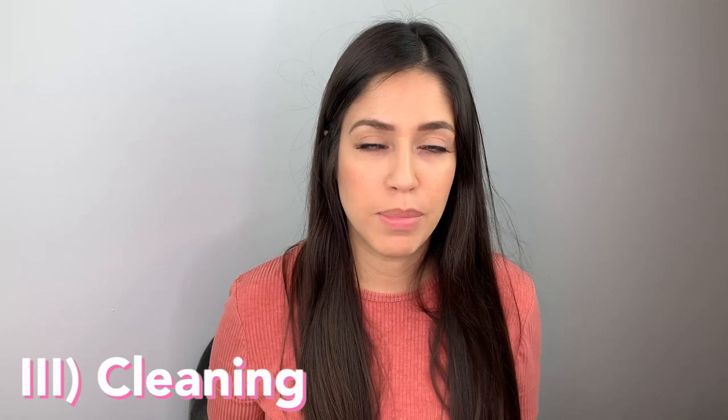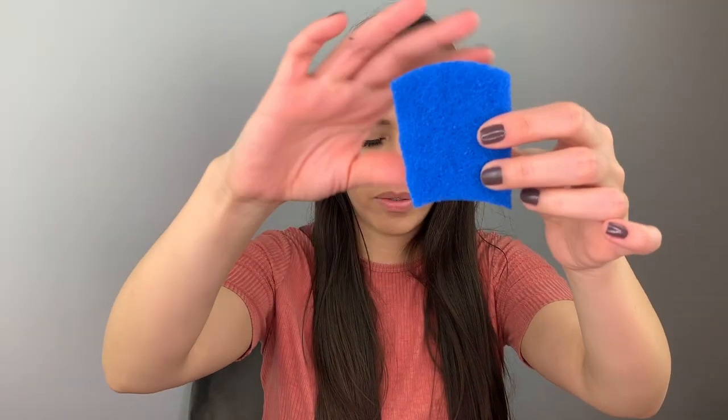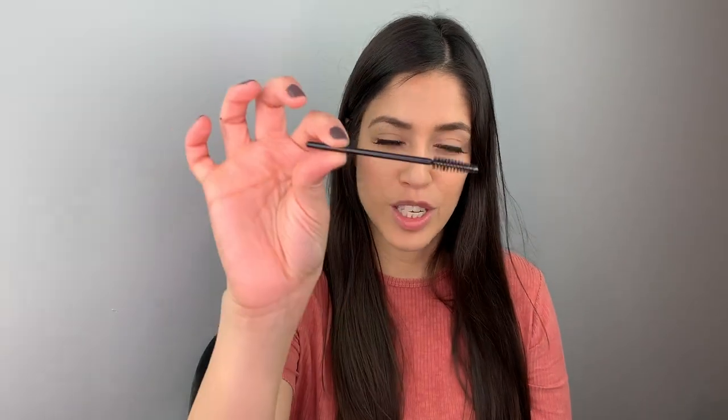Let me show you everything I use to clean these pumps every day. I grabbed a long sponge and cut it in the middle so I have a small sponge for it. I use the two brushes that came with the pump, and I sometimes use this small brush right here — if you saw my last video, you'll know where I got these from.